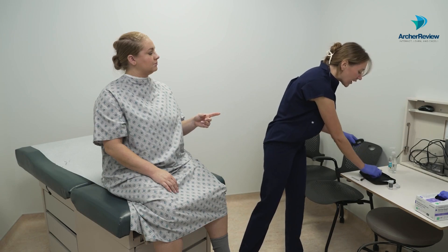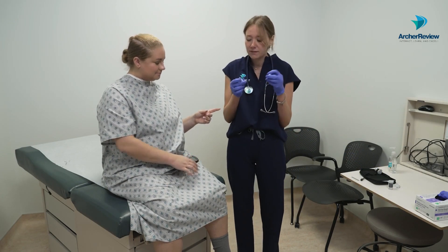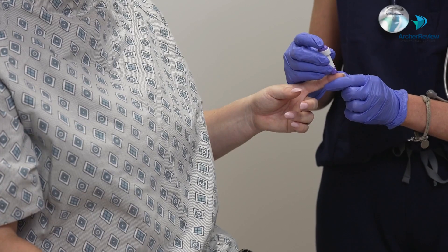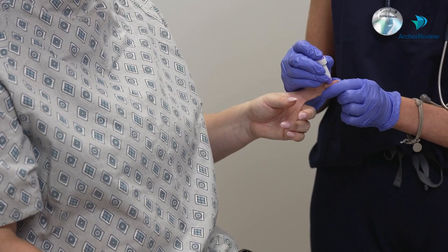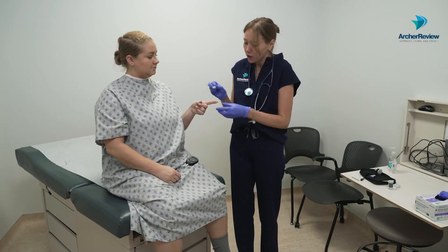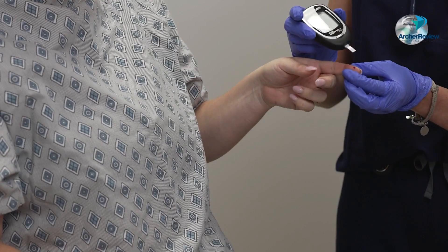At this point we can set that there and place it nearby. We have our piece of gauze and we have our lancet. Once you remove the tip of your lancet you're ready to go ahead and quick poke. You can then set your sharps in the proper sharps bin.